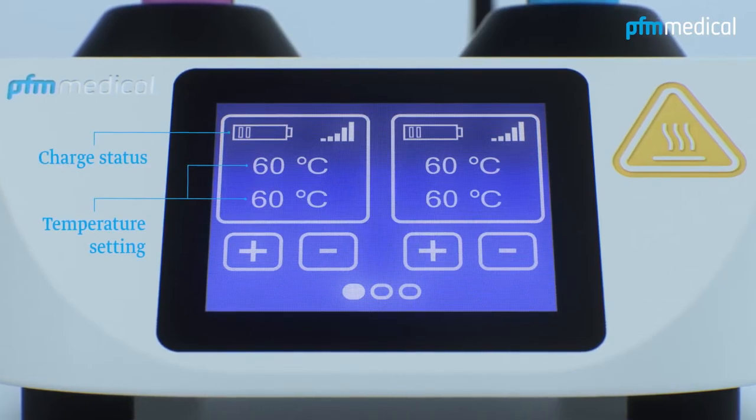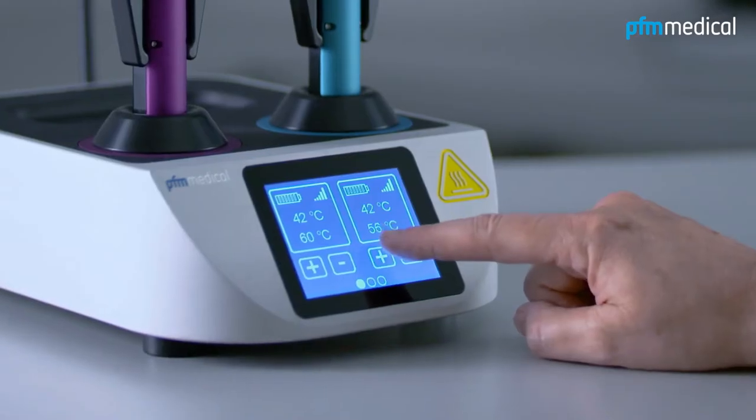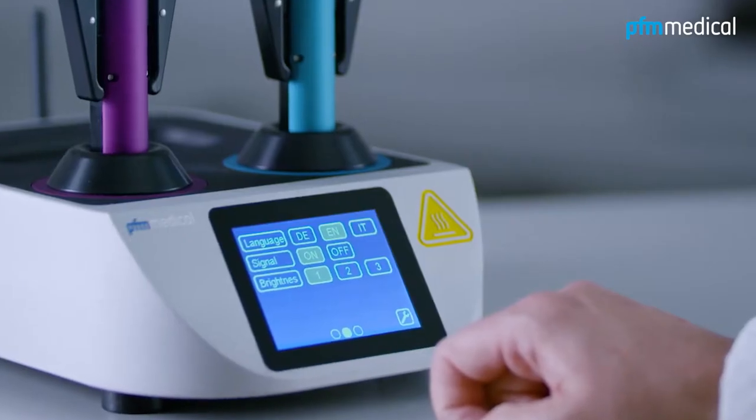Temperature setting, charge status, Bluetooth connection — all conveniently monitored and controlled via the touch screen and displayed at a glance. The display easily switches between the various display options by lightly swiping the screen.